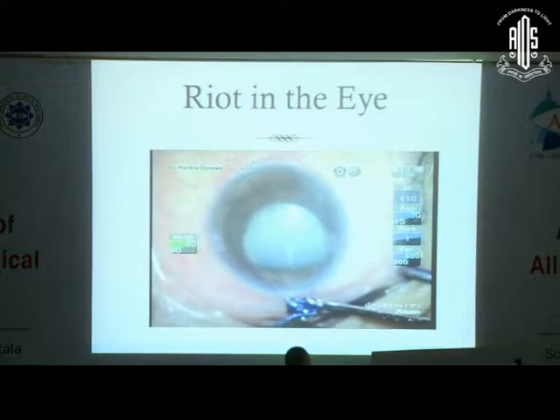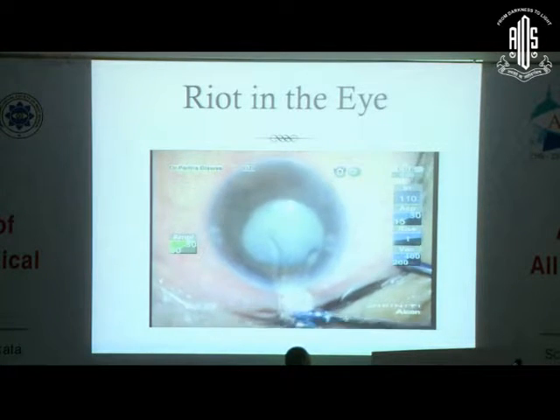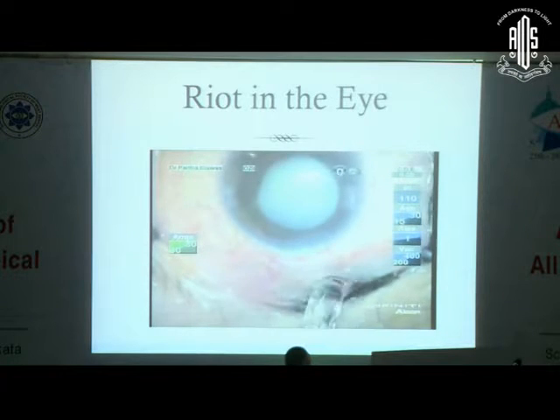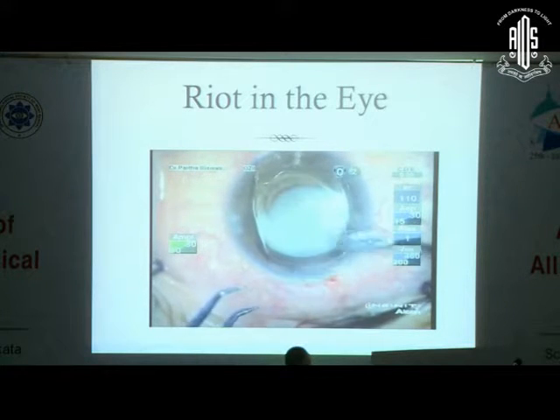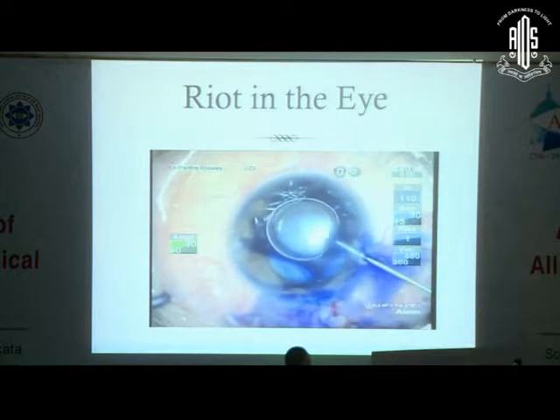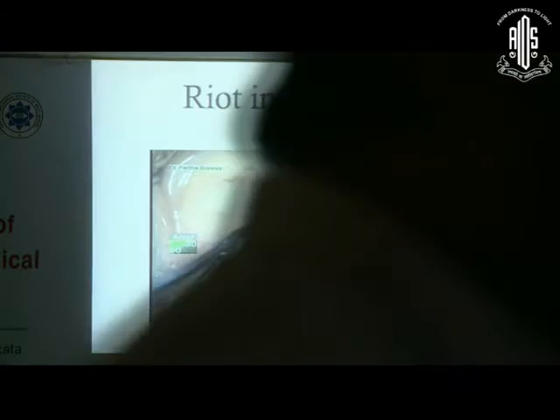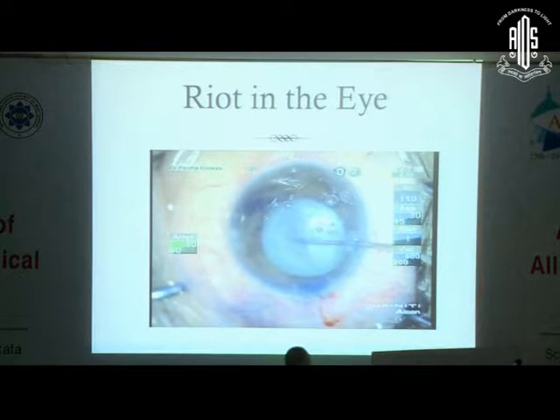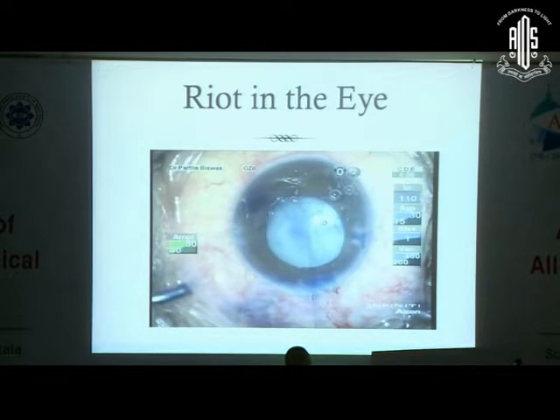There was no issue in the removal of the ICL — it came out intact. But the next part was difficult. I had already used high molecular weight viscoelastic, so the anterior capsule was not amenable to a good stain. I put in trypan blue after washing the anterior chamber nicely with BSS and got a stain that was okay. On the first nick, the rhexis started running out, so I immediately re-tamponaded with high molecular weight viscoelastic and removed the milky cortex from within using a cannula.